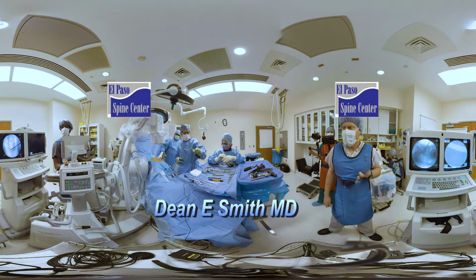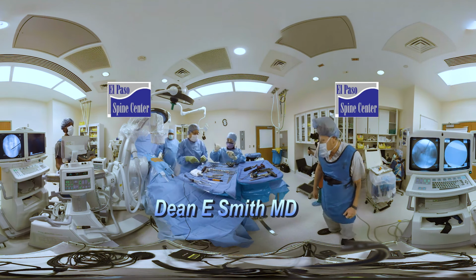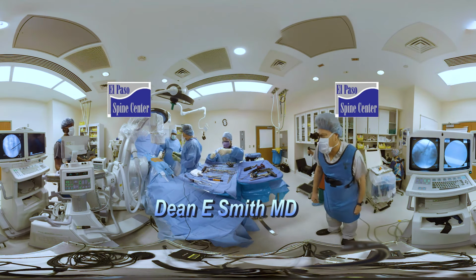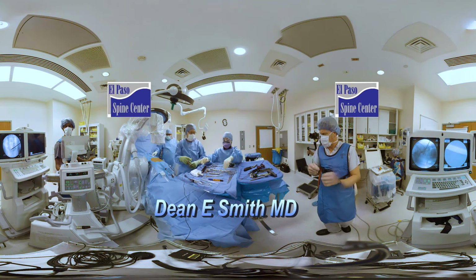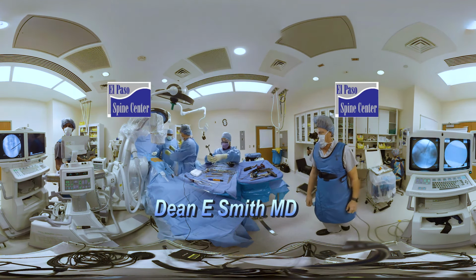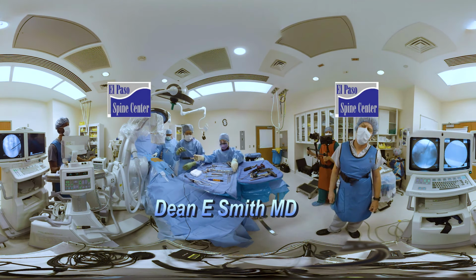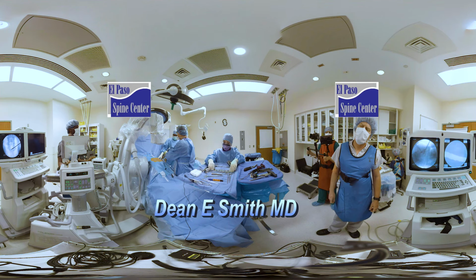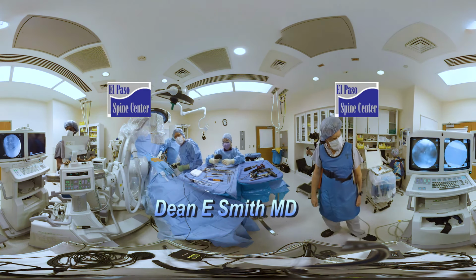Yeah, I like it. Okay, now we're going to take this out. You can see it's already opening up that disc space quite a bit. We'll see if this works. I don't know. It may go this way because. Yes, we took it off. Lateral. I like it.